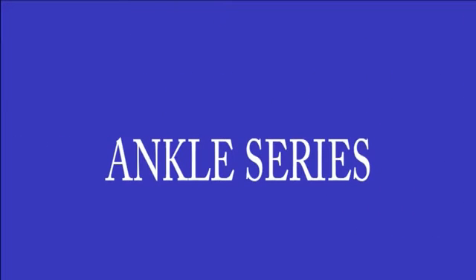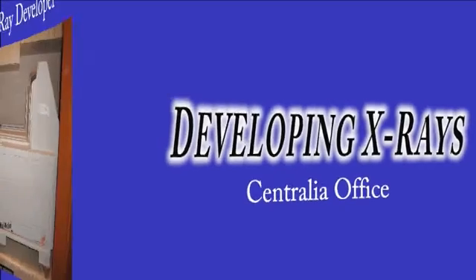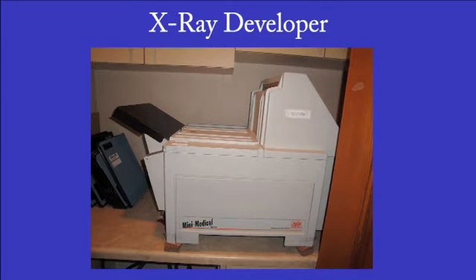You are now able to take an ankle series for any ankle concern you will come in contact with. After you have taken the views necessary for the patient, you will need to process them in the developer. It is important to realize that X-ray film is very fragile and light sensitive, such that it will be exposed if any light touches it. Though you will be shown how to handle film with light, understand this is only for training purposes, and every time you handle film it should be done in the dark.